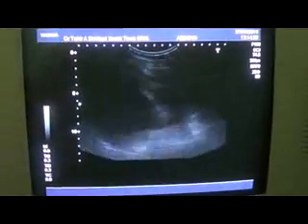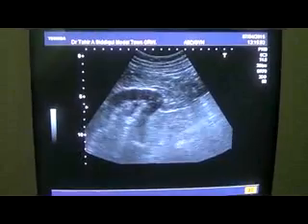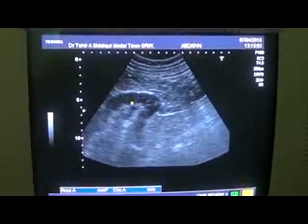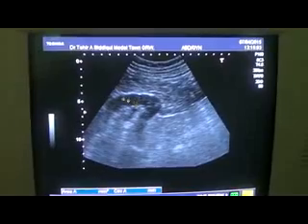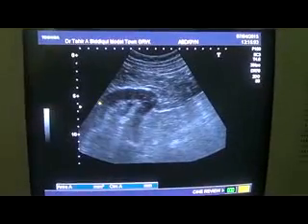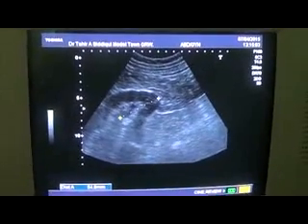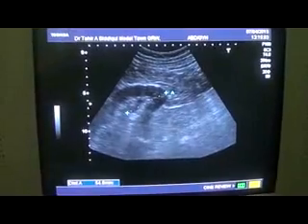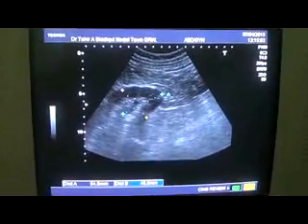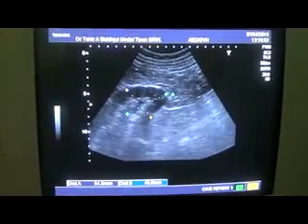This is the liver, this is the right kidney, and this is the lower pole of the right kidney. Parenchymal echogenicity is normal. These are the pyramids. They are normal, with intact corticomedullary differentiation. Now the upper pole, lower pole and part of the mid region show normalcy. No calculus is seen, no focal lesion is seen in this region, and the normal kidney measures 5.4 in length and 4.6 centimeter anteroposterior diameter.